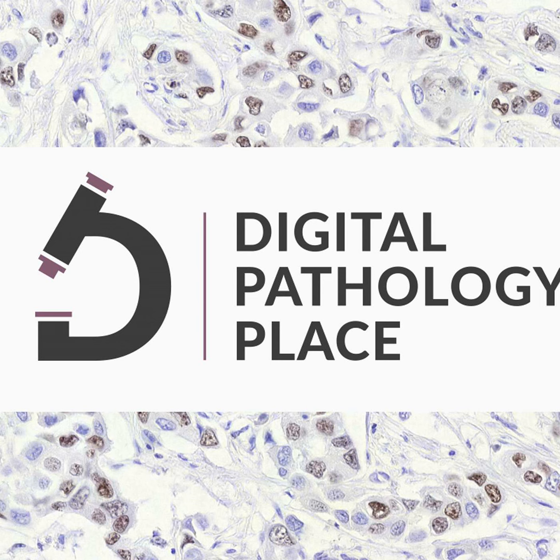So first of all, about collaboration. The finding we made when we started to work in 2010 and then in 2014 is that if you want to collaborate within digital pathology, you must have a central place where all the data, annotations, logging, history, etc. are stored. We were struggling because we were developing AI or giving teaching courses in digital pathology, and we had to ask the students to install a desktop application on their own computer. So everything they were doing remained on their computer. We did not have any feedback.